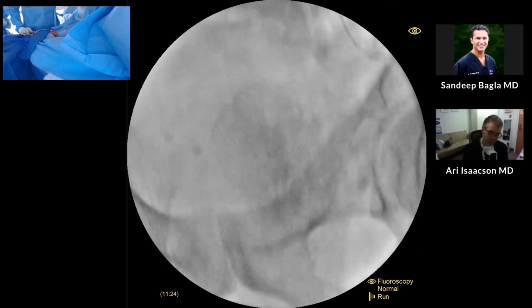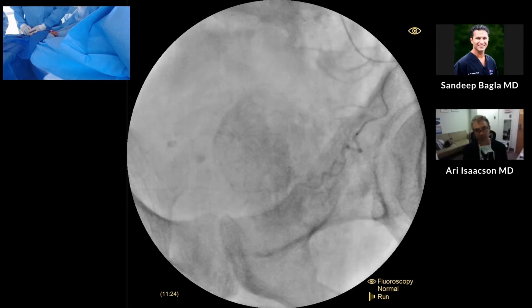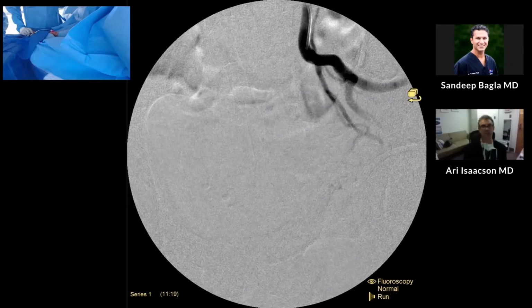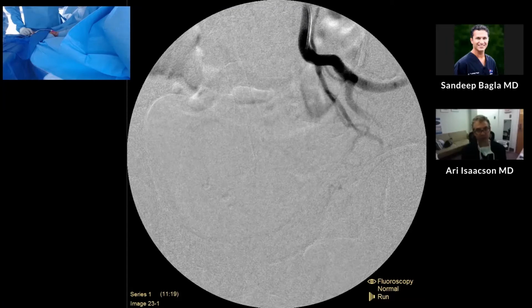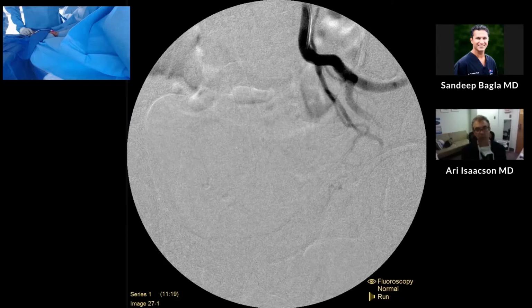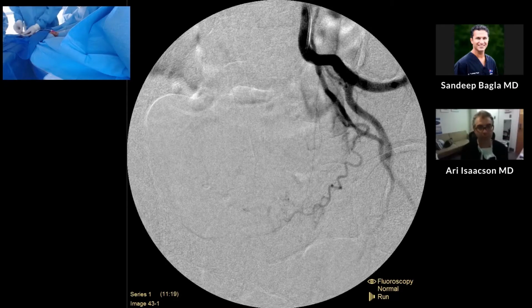Let's go back to the anatomy in this patient for a second, because I saw your initial run. It looked like he had a pretty big prostatic artery arising from, and in this particular patient, you have a little bit of a variant, right? You have the inferior glute coming off the posterior division with the superior glute. You got it. So your anterior division is really only made up, it looks like, and I don't see an obturator either. Yeah, so it's made up of just a pudendal. And off that pudendal really is a vesicoprostatic trunk, that very first branch.